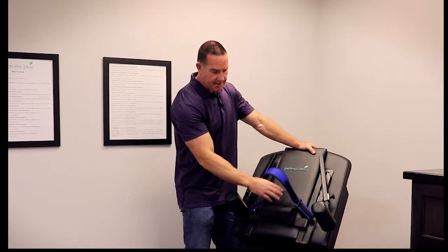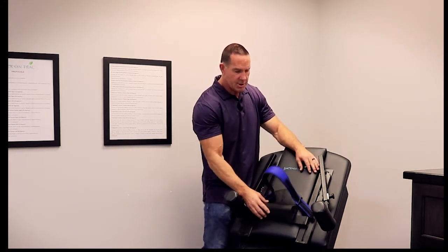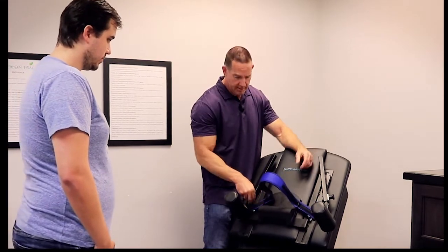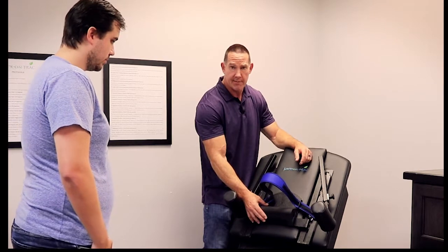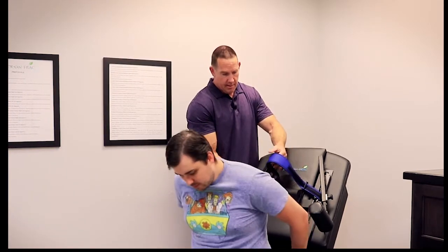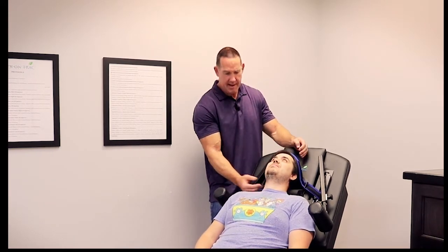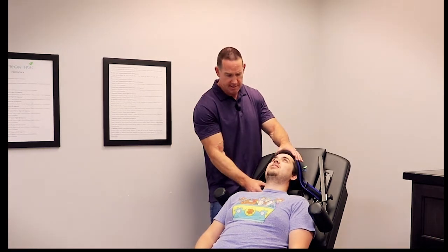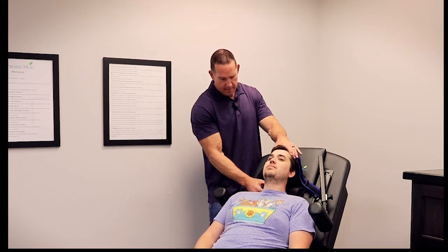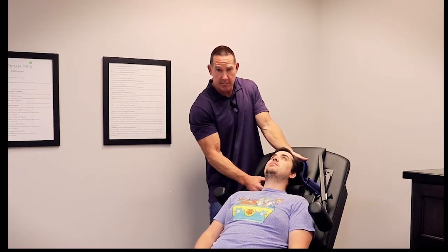So we're going to lay the head back and I'll show you that. Seth, come over here. Make sure we have this loose as we get the patient on so we can adjust the height — make sure your bolts are loose when we have this set up at first. Have Seth just come lay back. Here's the big issue: if you have this set up correctly, the head's going to really lay back and just sit perfectly back over the top of that thing. If we have this too high, it actually holds the head up off of the back.